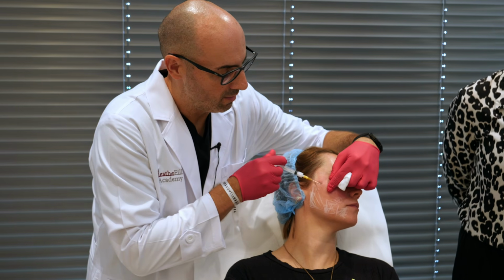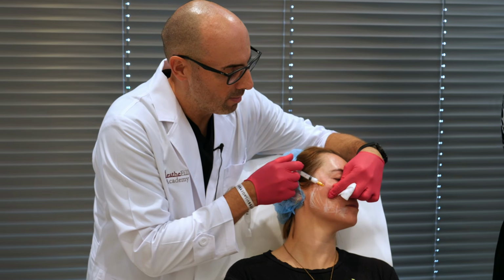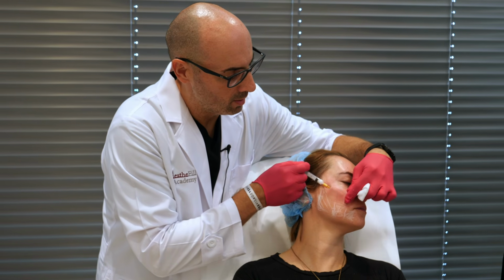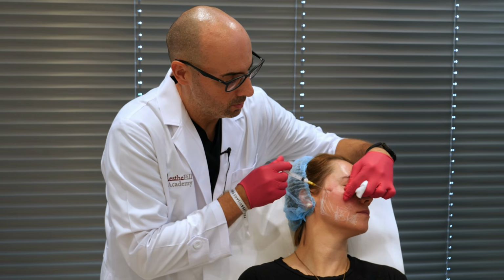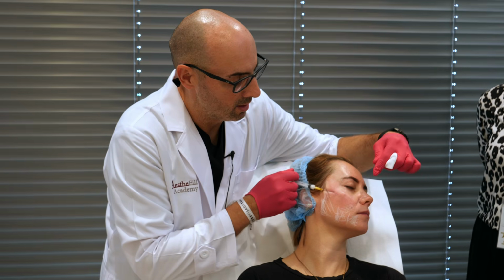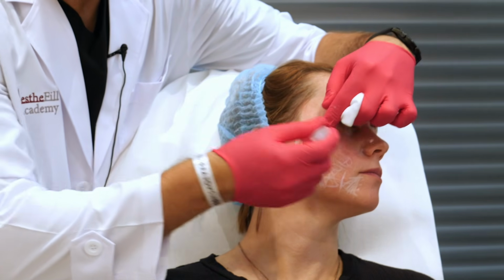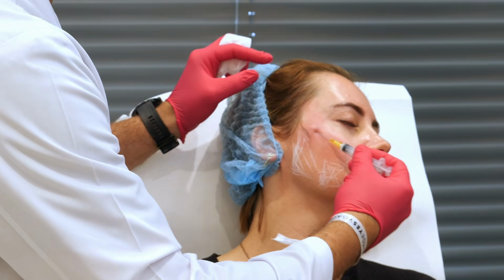Here, if the loss of volume in this zone is very high, you can use two planes to obtain a better repositioning of the tissue. Okay. Change the plane, and with the cannula inside, we change the vector in the other direction.